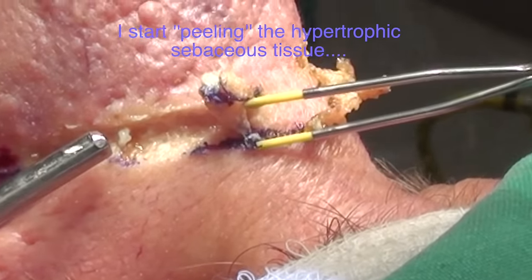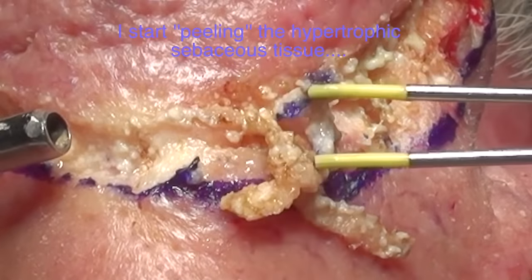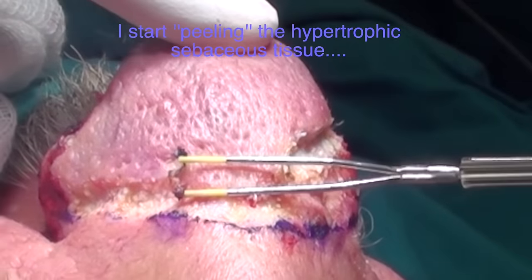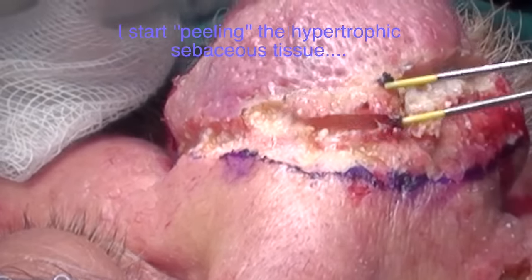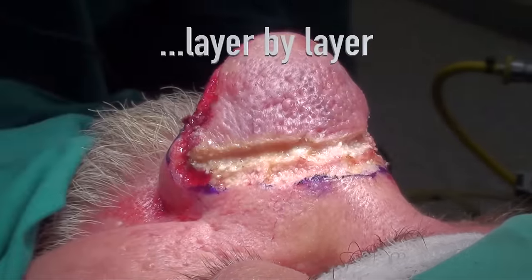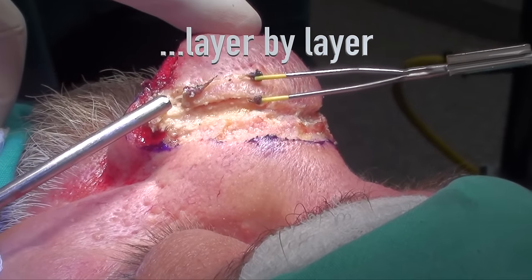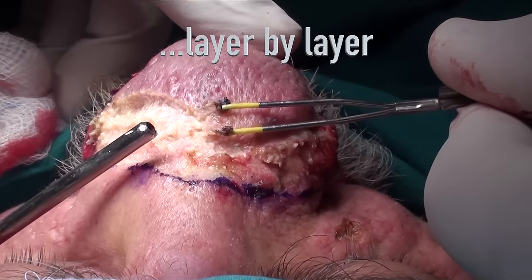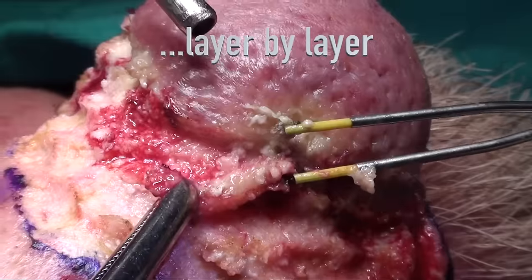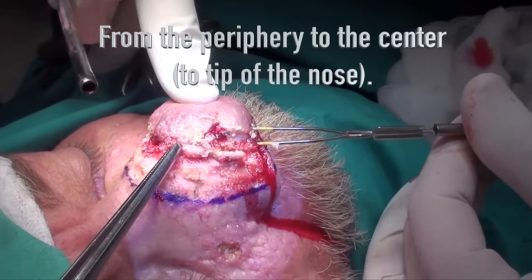I start peeling the hypertrophic sebaceous tissue, layer by layer, from the periphery to the center — the tip of the nose.